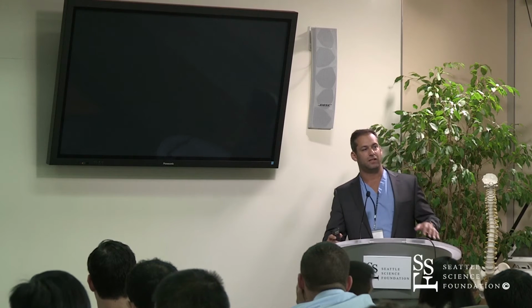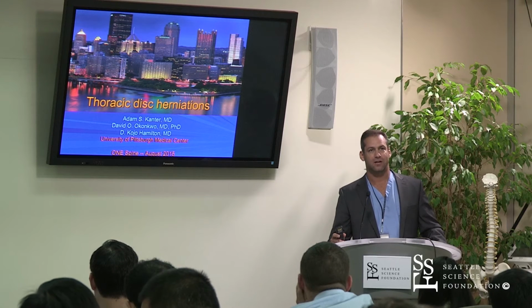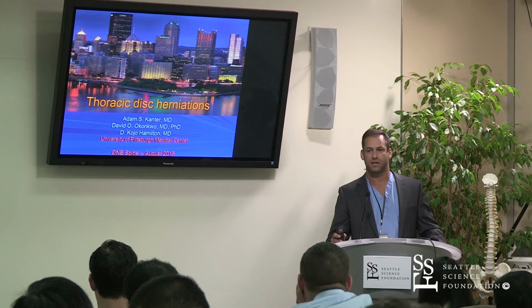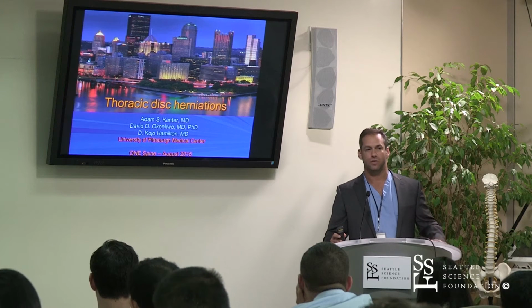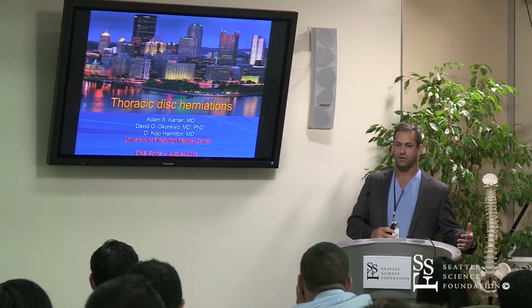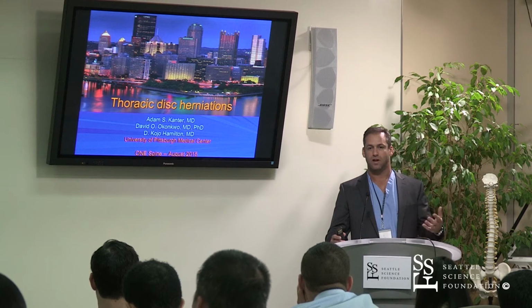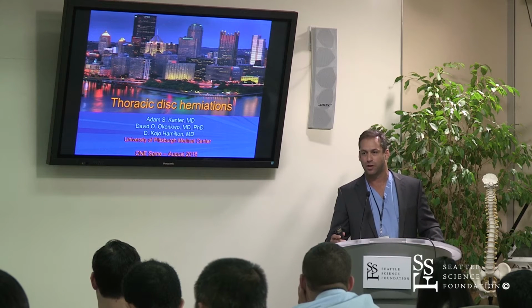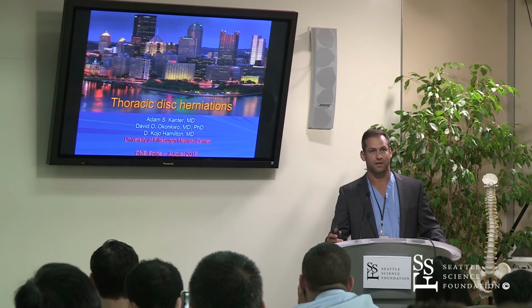We're slightly out of order here, because I'm presenting lateral access to thoracic pathology, primarily disc herniations, which is what we're going to deal with as neurosurgeons and orthopedic surgeons. Typically, you would go after someone presents the more traditional lateral interbody fusion, where you learn a lot of the basics and where your workhorse is. Then, after you've done your first 100 of the lumbar spine, you'll consider going up into the thoracic spine.